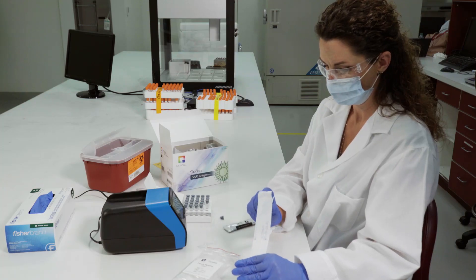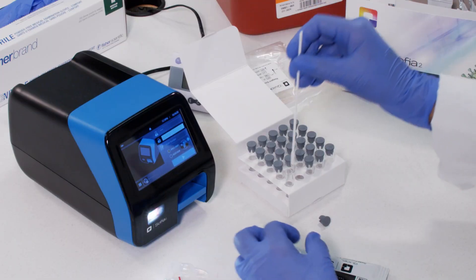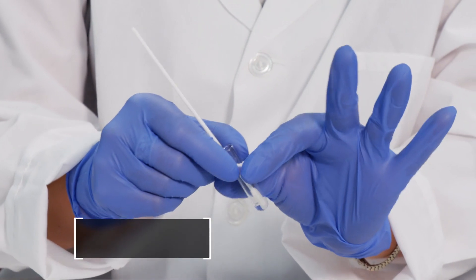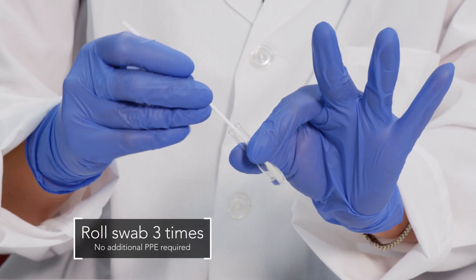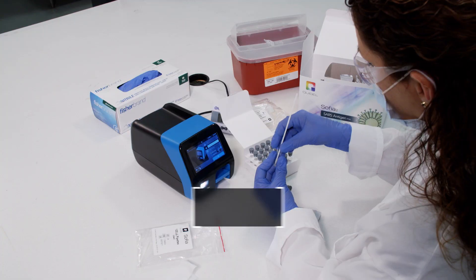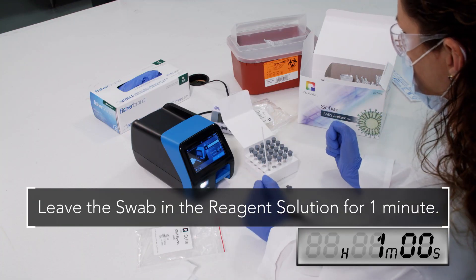Remove the swab from its sterile transport package after proper collection and place it in the reagent tube. Roll the swab at least three times while pressing the head against the bottom and side of the reagent tube. Leave the swab in the reagent solution for one minute.